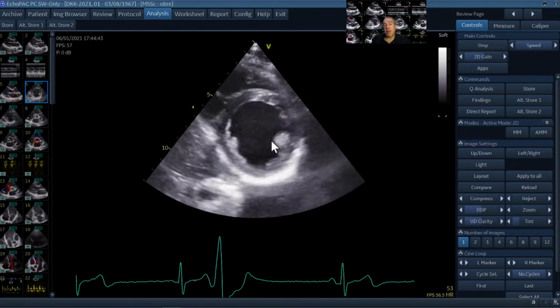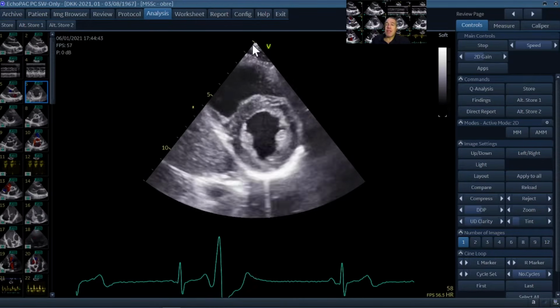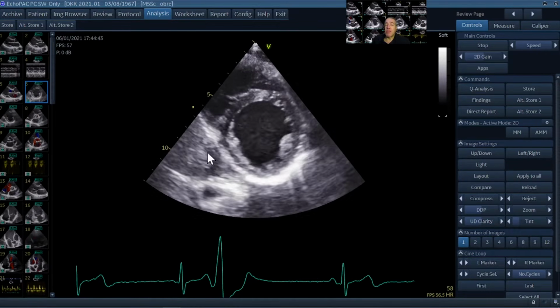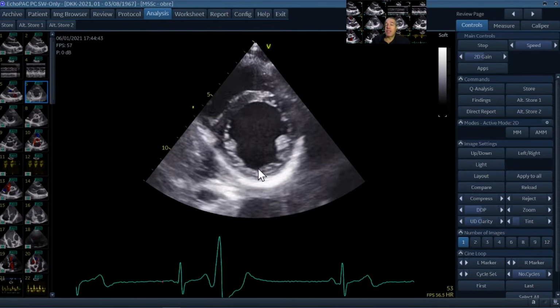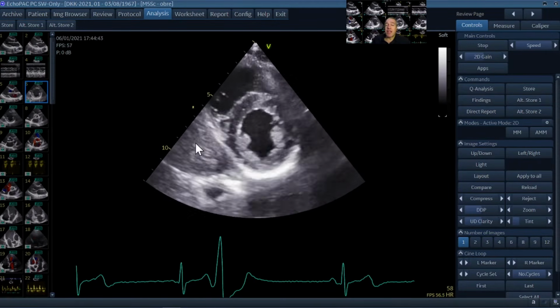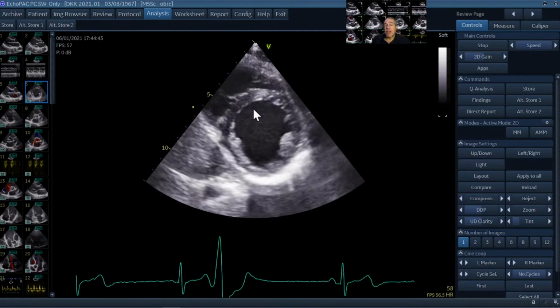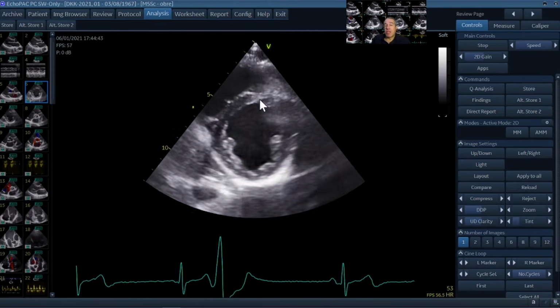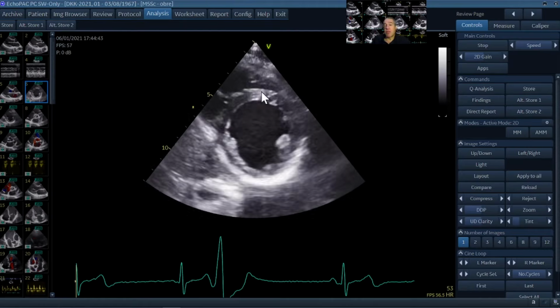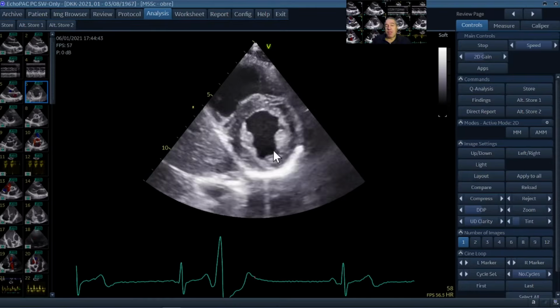When I go back to the papillary muscle level, please also note this is anterior, this is the back of the patient, so here comes the spine, this is posterior, this is inferior. We call this now the inferolateral segment, and this is the inferior segment, this is part of the liver here. Again, here part of the right ventricle, anteroseptum, which is part of the right ventricular outflow tract, typically if you go a little bit higher up, and this is a free wall of the left ventricle.